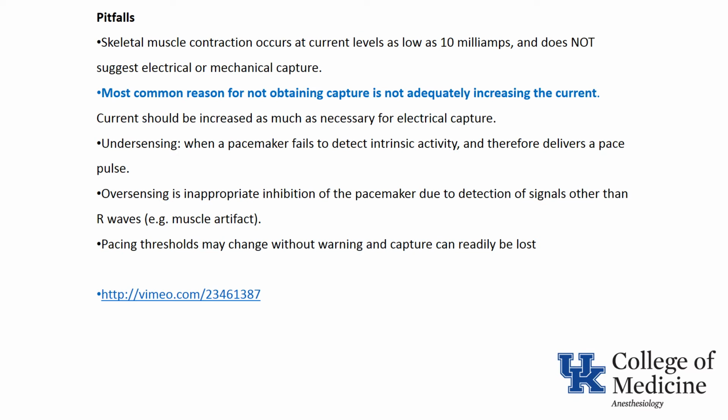There is a short 3-minute video which you can watch by copying the browser link shown at the bottom of the slide, and if you want to see a demonstration or a simulation of transcutaneous pacing, that is a link that you can try.